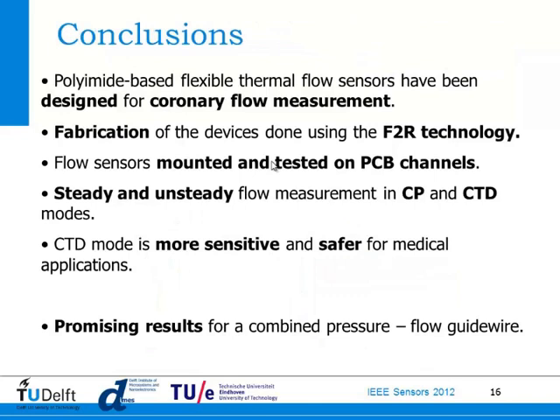In conclusion, we have designed and fabricated thermoflow sensors especially made for blood flow measurements inside the coronary arteries. The fabrication has been done using a dedicated technology called F2R, and we have mounted and tested those on PCB channels under both steady and unsteady flow with both constant power and constant temperature mode. The CTD mode is more sensitive and also safer for medical applications. So the results are very promising for the combination of pressure and flow at the tip of the guide wire.